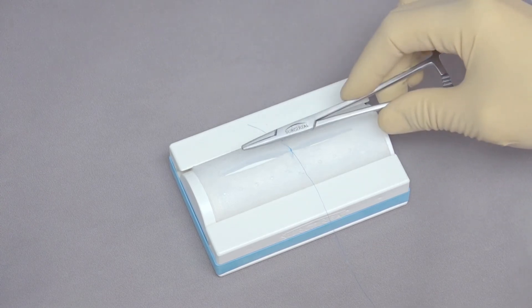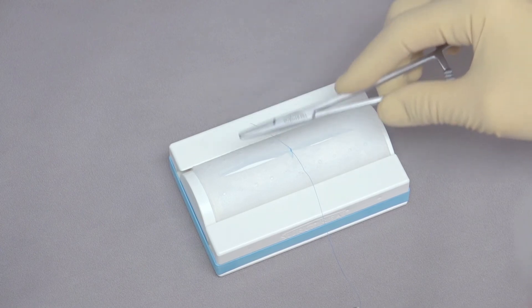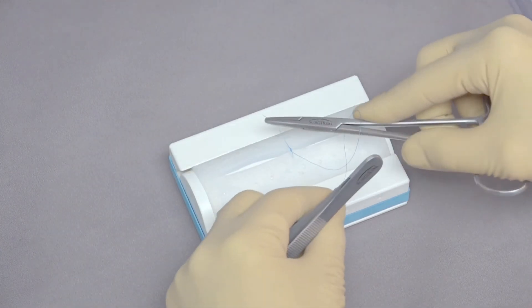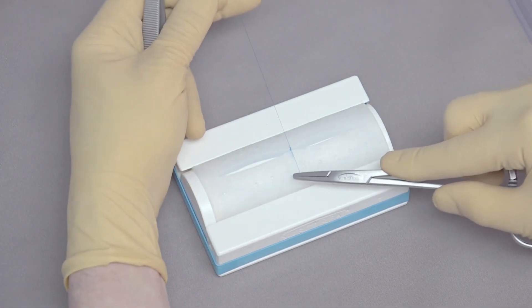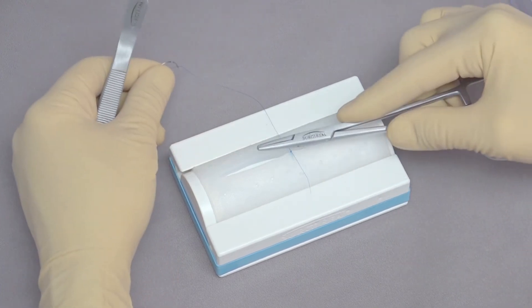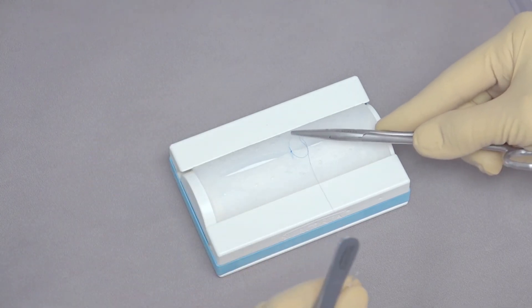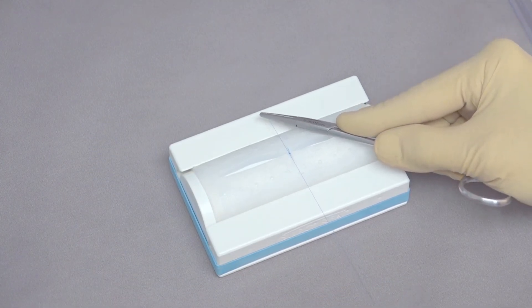Put the needle holders in the middle again, not on one side or the other because that would be a granny knot. We want to do a square knot, right in the middle, around one time, grab the suture, make sure that stays nice and even, and on this one we can lock it very well. One more to finish it up, so fourth throw square knot. Typically for most of our suture materials, nice and flat, no tension, and we can tighten that down.